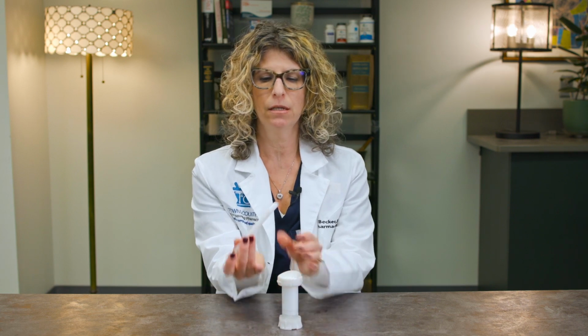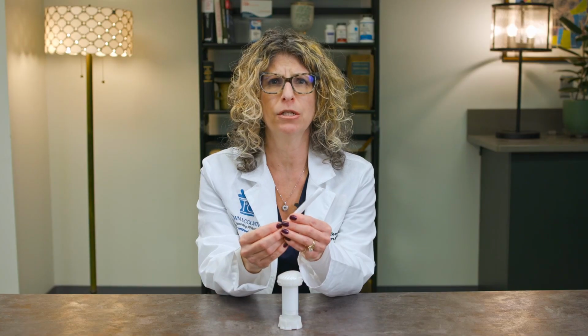Once you've turned 4 clicks, you can then remove the applicator, close the top of the device, and then you can insert the applicator vaginally. Once it's inserted, you press the plunger and the cream will be inserted into your vaginal area.